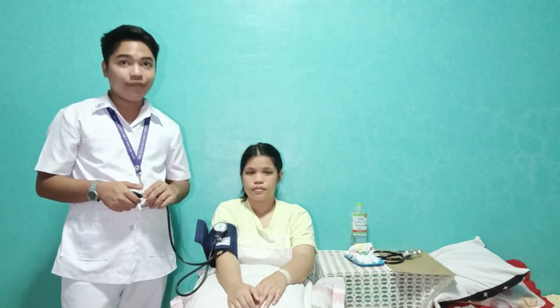For the actual taking of her blood pressure, I'm going to need to inflate the cuff about 30 millimeters of mercury higher than the estimated systolic pressure. This is to avoid missing the auscultatory gap, which is the temporary disappearance of the Korotkoff sound while deflating the cuff.